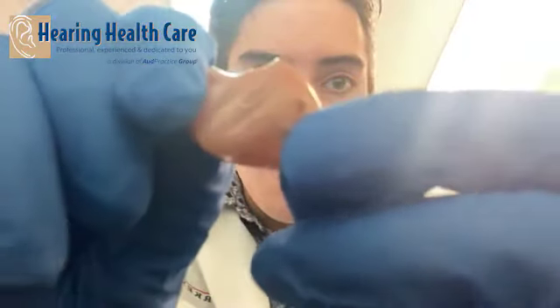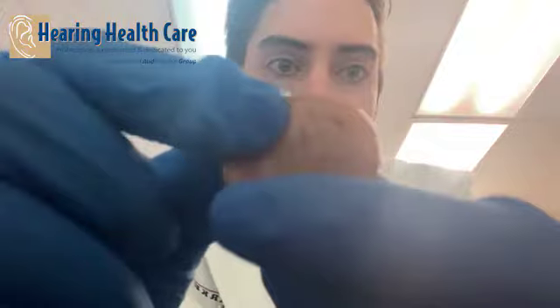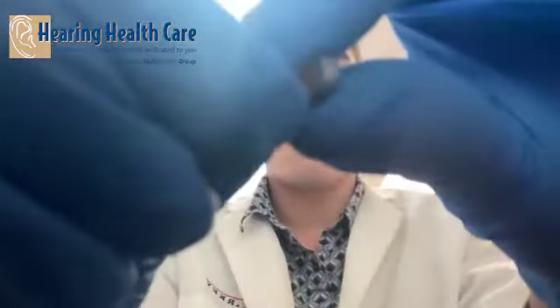For my custom hearing aid, the battery door is on the back. You can see the tab right there — pull that, and it opens up the battery door. This is a 13 battery, which you'll use for the bigger full-shell customs. Pull off that orange tab, leave it for a few minutes if you're able to, then put it right in the battery drawer compartment. Make sure it's flat against the top so it will close and start up.